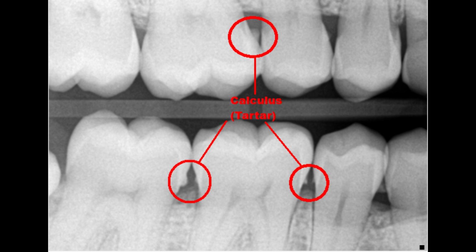But the x-rays are very useful in helping us to determine bone levels. We would not be able to do that without them. We can detect the calculus, but this is a great way to educate the patient and also to know exactly where that tartar is, so we're not going at it blindly so much.